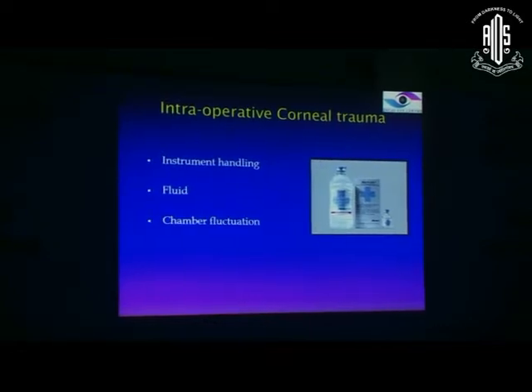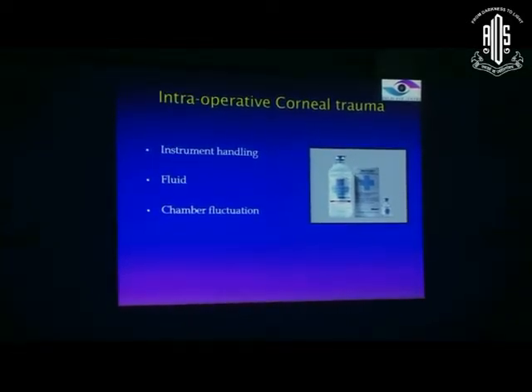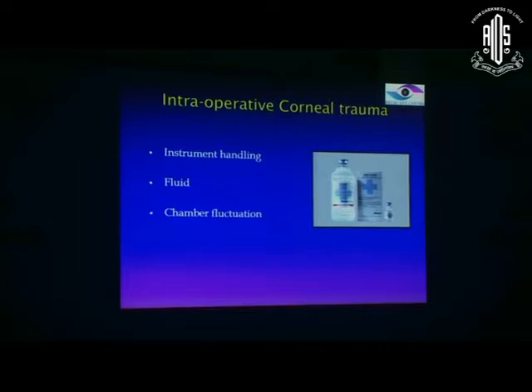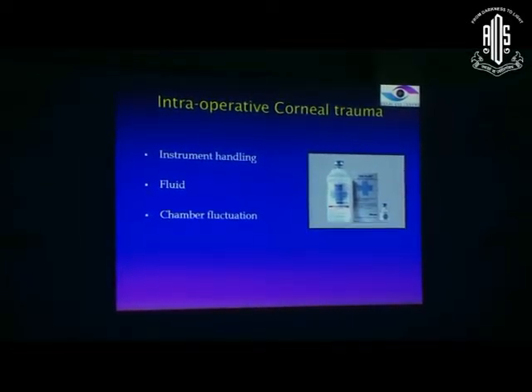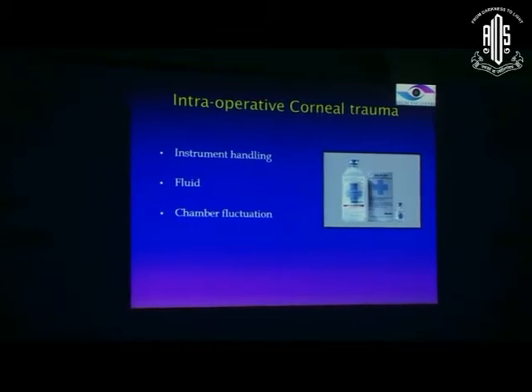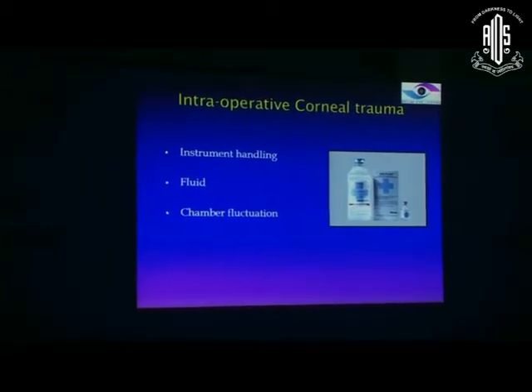The amount of fluid going in as well as the concentration of the intracameral antibiotics and the lignocaine that we use can add to the toxicity. And wide variations in chamber can also cause transient corneal edema. So all of these things we need to keep in mind when we're doing the surgery.